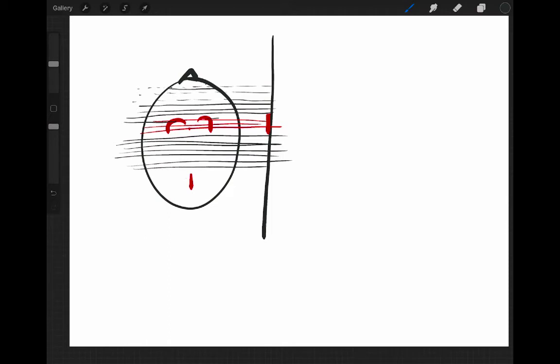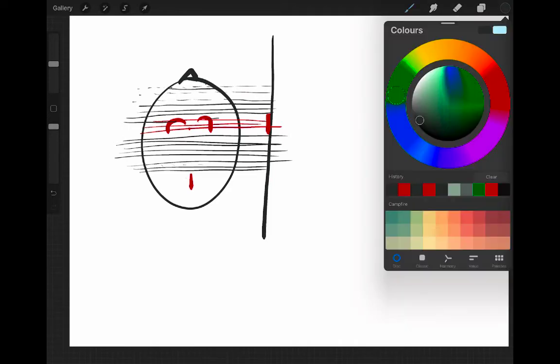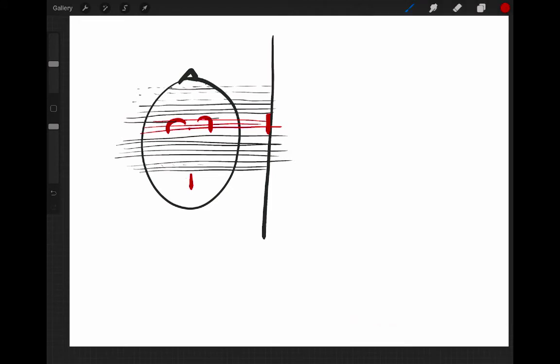Okay, so these projections all result in very low values, right? Because the intensities are only high in the blood vessels. And as soon as we come to that object down here, we're back at encountering very high intensities as we project through, and that's what ends up here. Okay, so you can already see in this diagram that this maximum intensity projection is sort of blind to things that are hidden behind something else.